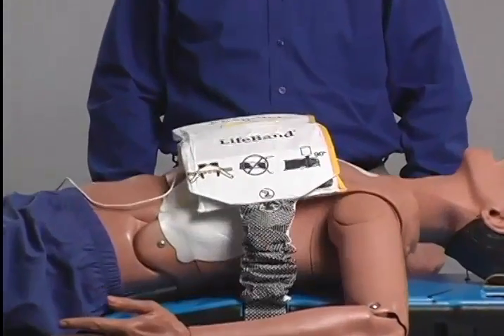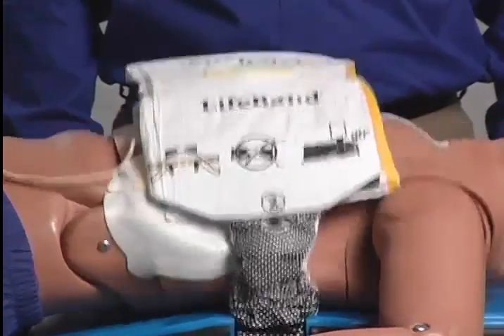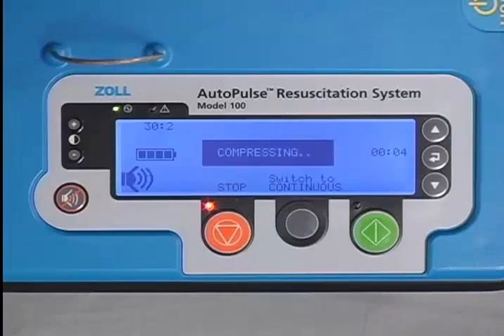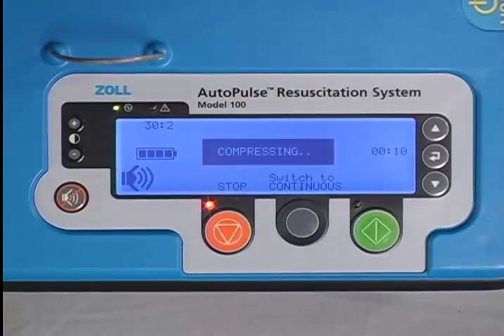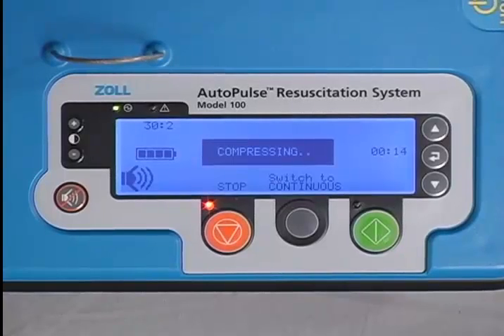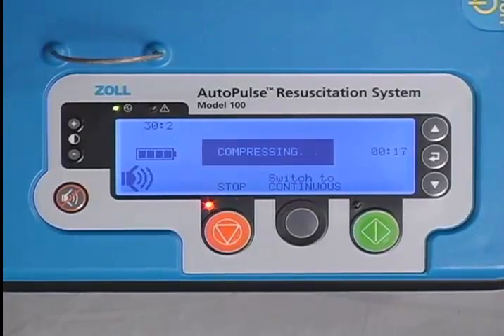In keeping with current AHA and ERC guidelines, the Autopulse is pre-programmed to a default 30 to 2 compression to ventilation ratio. It performs 30 compressions, followed by a 3-second pause to deliver 2 ventilations. There are 3 audible tones that sound during the 28th, 29th, and 30th compressions to give the person performing the ventilations adequate notice that it will soon be time to ventilate.